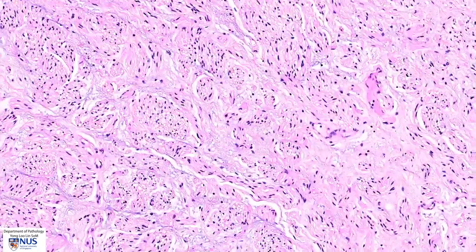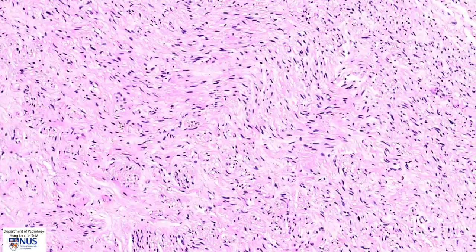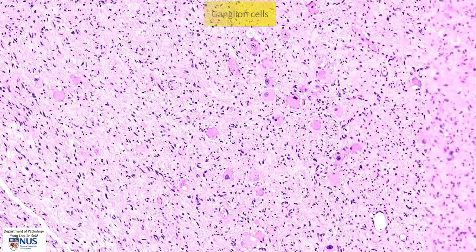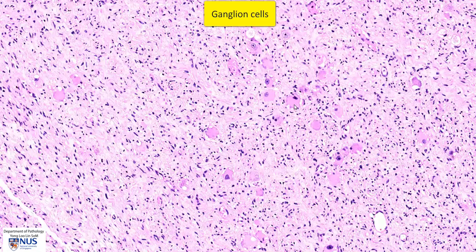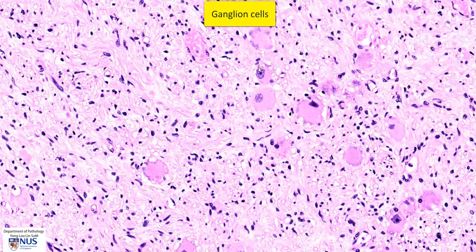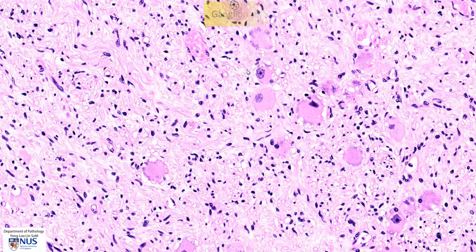Moving over to this area, we start to see these very large cells. These are ganglion cells, and they form the ganglion aspect of the ganglioneuroma. Ganglion cells are large polygonal cells with round nuclei, prominent nucleoli, and very abundant eosinophilic or pink cytoplasm.